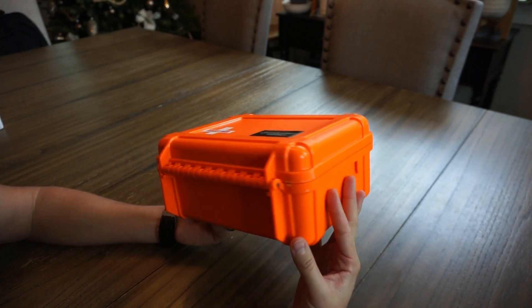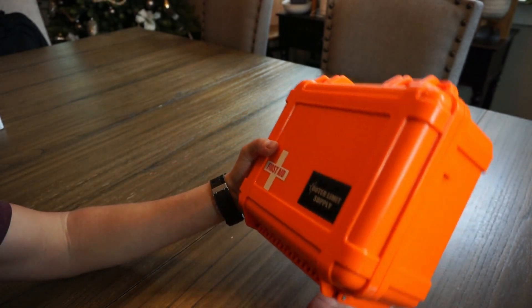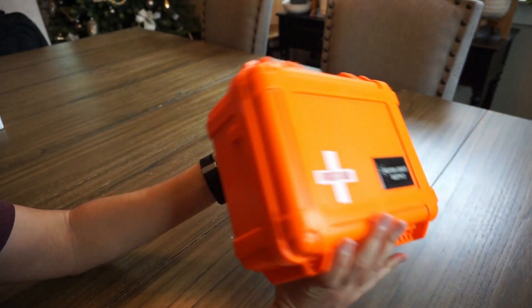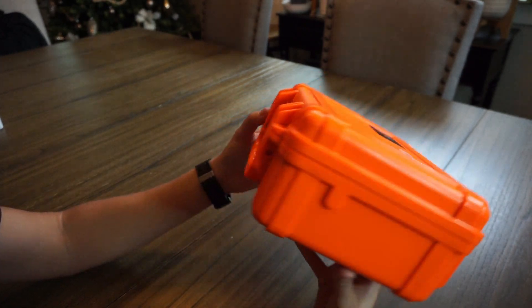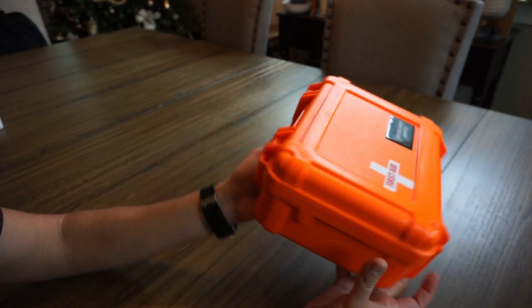It's a heavy-duty case — waterproof, fairly crush-proof, and dust-proof. It's not a Pelican case, but it's basically the same thing. It's from a company called S3 Cases. You can see it's decently sized, fairly compact for how much stuff is actually in here.